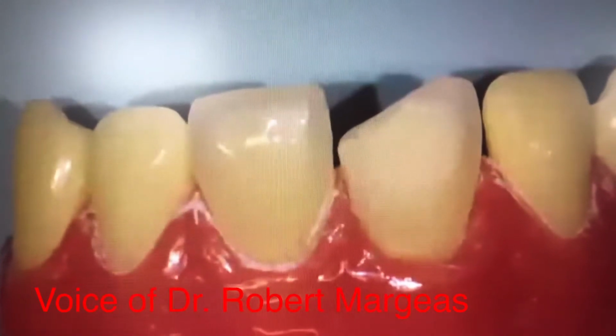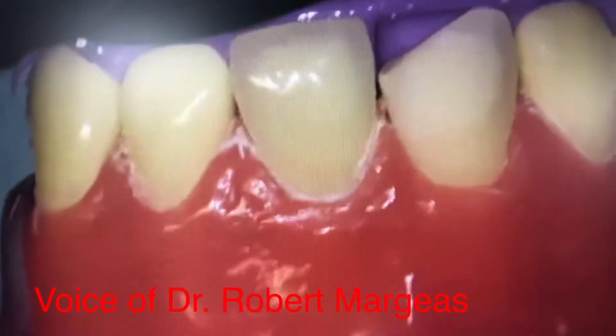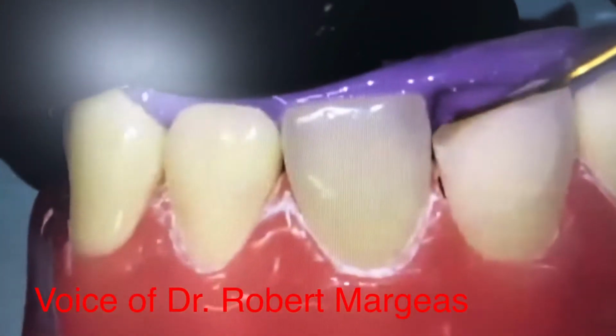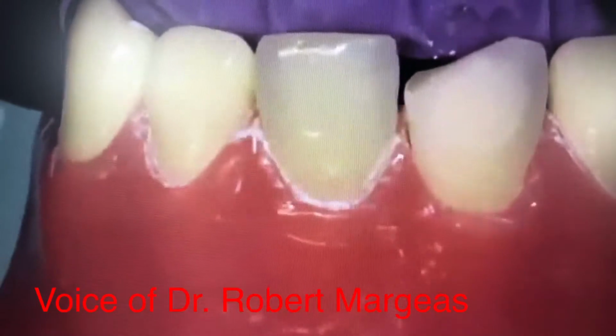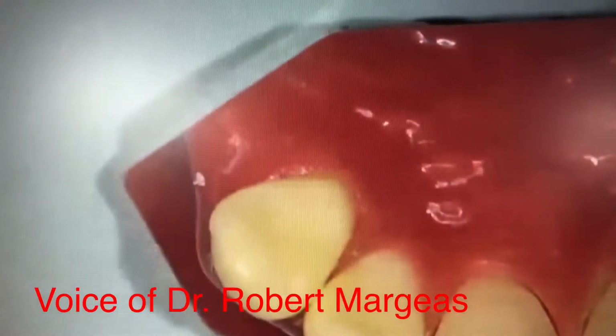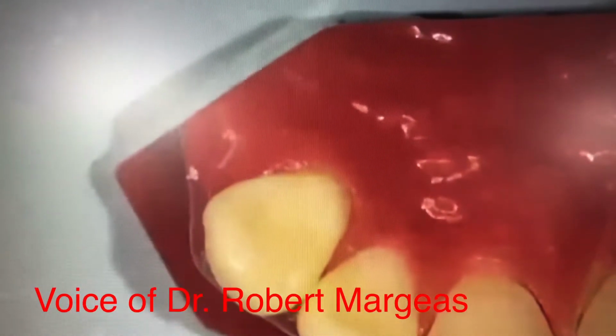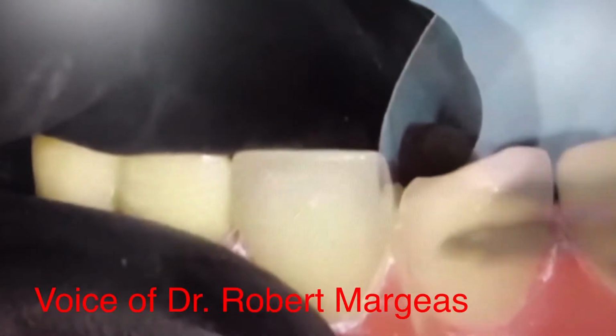very opacious layer. So once I have that, take your lingual matrix, place it on there, and then I want to scribe a line onto my template matrix so I kind of know how much material to put on. Okay, you can see that's what I'm going to put on the tooth. The important thing to remember is when you're etching this tooth, you don't want to get etch on the adjacent teeth or the adhesive. So I'm going to take some MPA, maximum performance adhesive. It's meant as a 5th generation one, would be like Single Bond, onto the tooth.